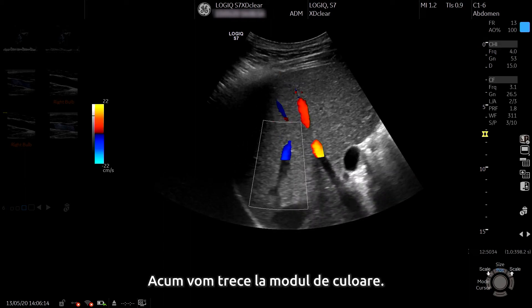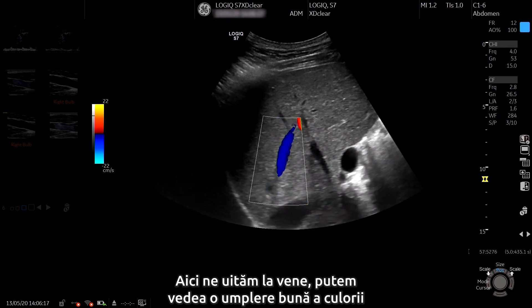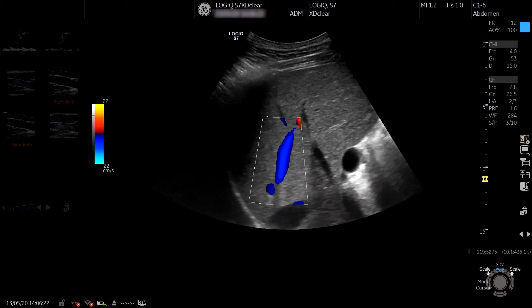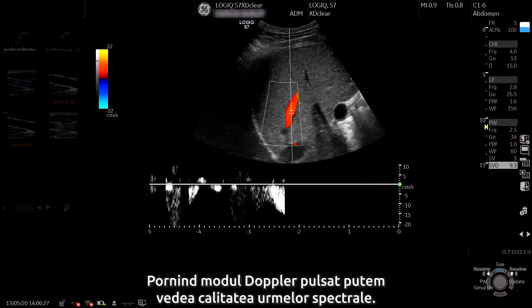Now we're going to move to the colour mode. Here we're looking at the hepatic veins — we can see good colour filling and good sensitivity. Switching on the pulse Doppler mode, we can see the clarity on the spectral trace.